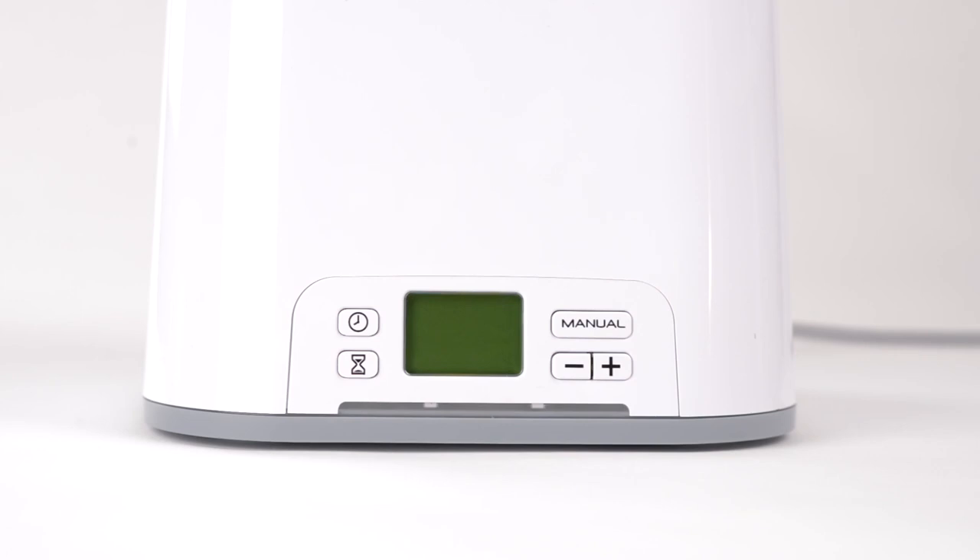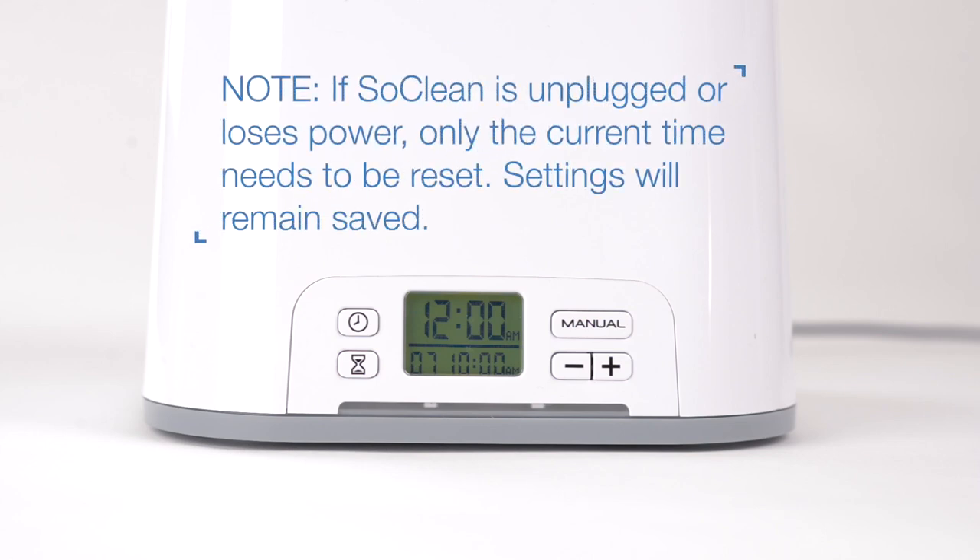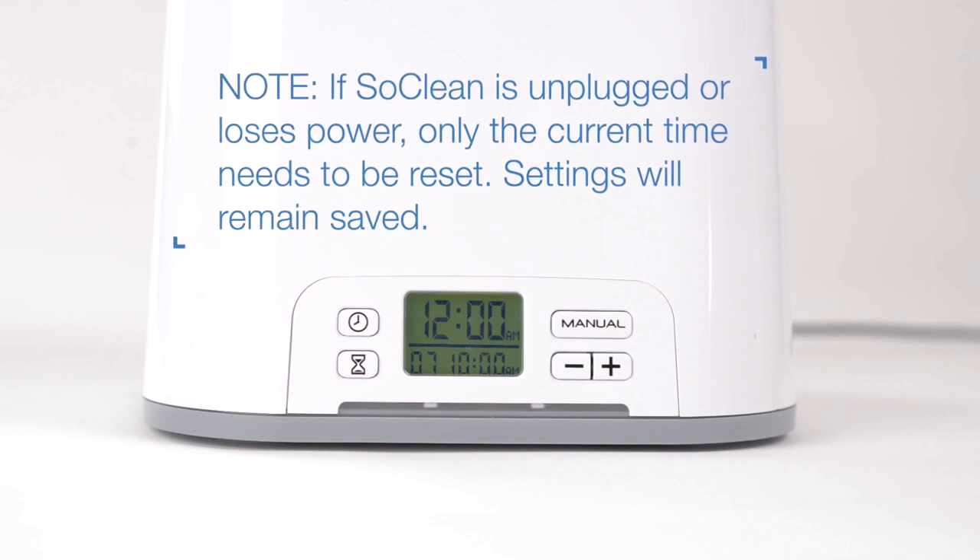Your SoClean 2 timer will allow you to completely automate your daily maintenance after connecting to your sleep equipment. The SoClean 2 comes preset to start a 7-minute cycle at 10 a.m. daily. However, you must set the clock to your current time. If you unplug the SoClean or experience a power loss, you will need to reset the current time only.